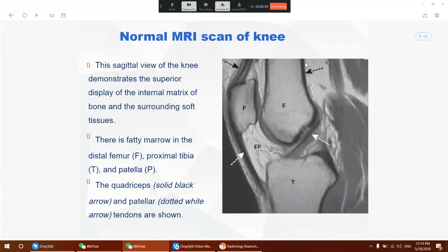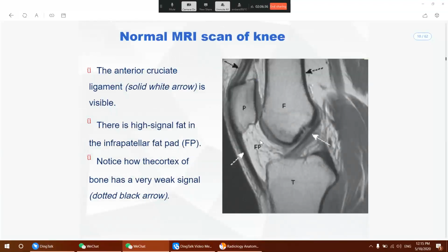You understand? And then I'm also going to look at the cruciate ligaments, which are forming, tangentially passing from the posterior side of the femur to the anterior side of the tibia, crossing over. Such a kind of ligament I'm going to look at is the cruciate ligaments. Unless I know the anatomy of the joints, unless I know what muscles and tendons are present around this place, determining and reading an MRI might be difficult. So that's the reason I'm asking you to come back and cover your anatomy, okay?